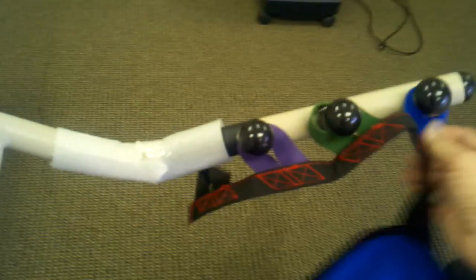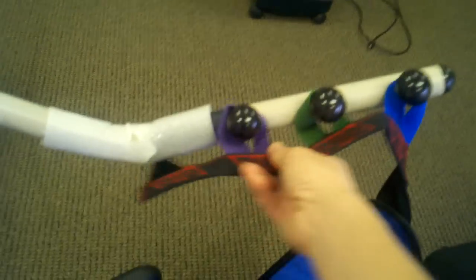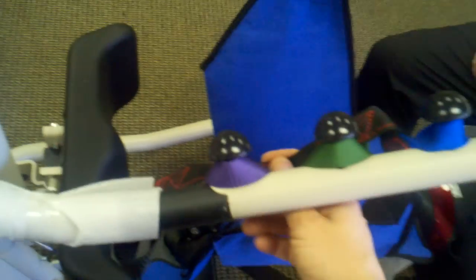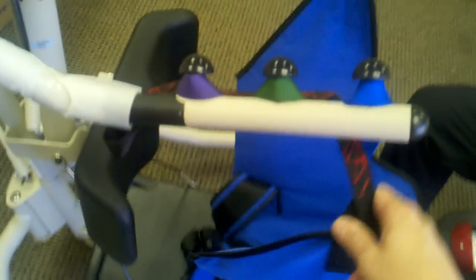I went ahead and put it around these six points. This is a lot easier than a typical patient lift or a Hoyer lift — they've made it a lot easier by color coding it so that you know where to put it. Before, in the last couple of years, it's been pretty difficult to figure out for someone doing it for the first time.